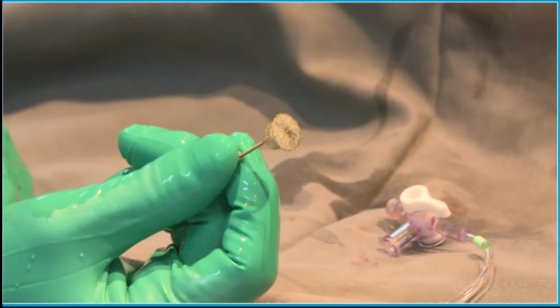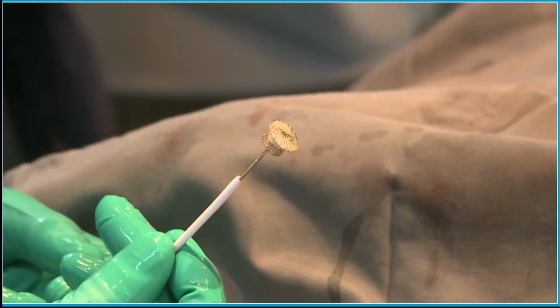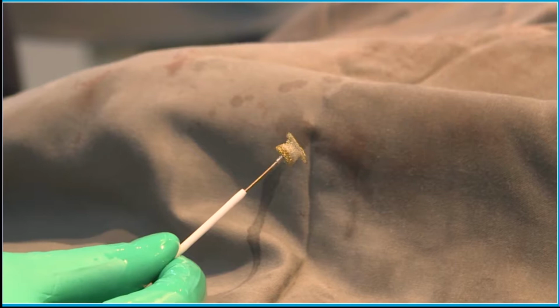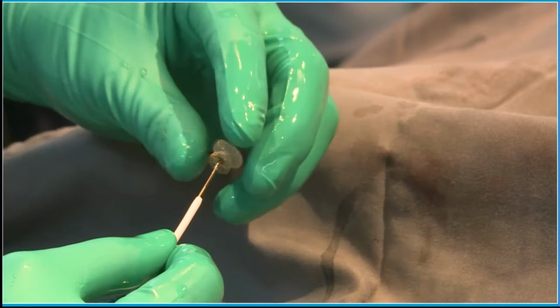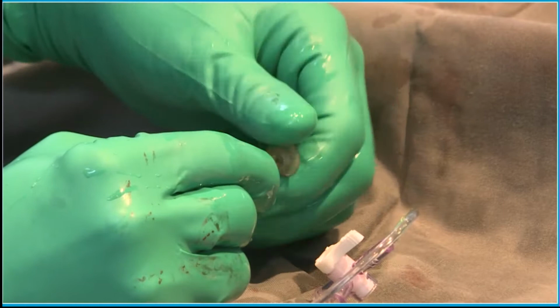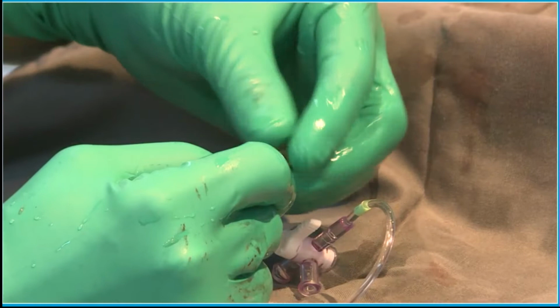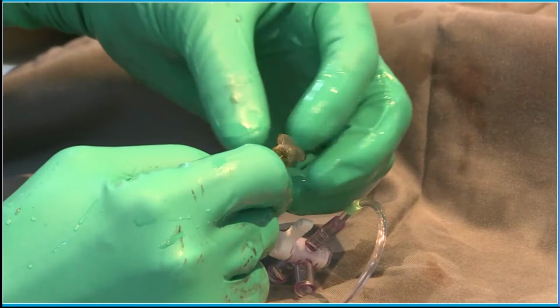Is the size of the device which you have taken okay? It is questionable. I agree with Bharat, because Bharat is also saying that the company's comment about the retention, the PA end being able to hold the duct properly, is questionable. Yeah, I think this device was created more for some of the length issues rather than the true anatomy of the duct for the PA end. The longer length devices have their use, but I'm not sure the short length devices are any different from the ADO. Also, for off-label use the length is 7, 6 mm. But I doubt that reverse sizing has made any significant difference, because with ADO 1, stability was rarely an issue if you chose the correct size of the device.